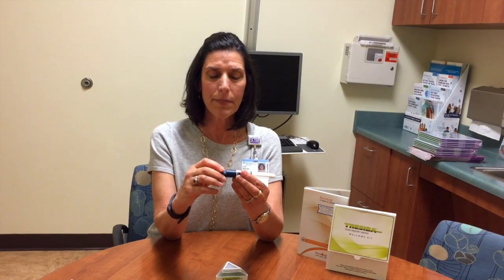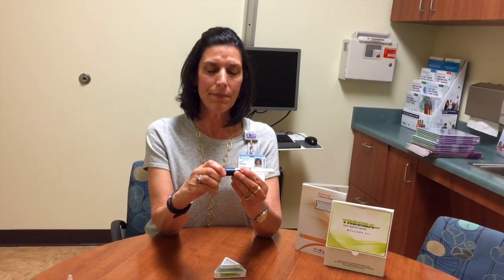Then what you're going to do is dial in the correct dose of insulin that you need at that time. For example, let's say I'm going to dial in four units of insulin, so I'm at the number four on the pen dial. You're going to hold the pen like a dagger and put your finger on the little white button.